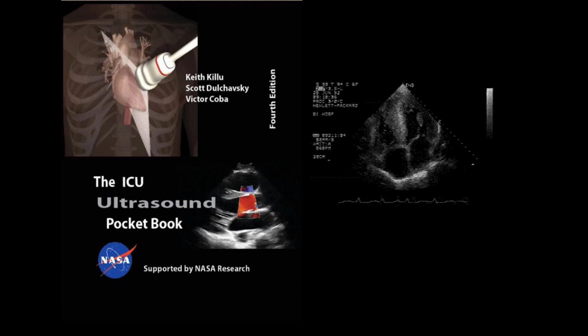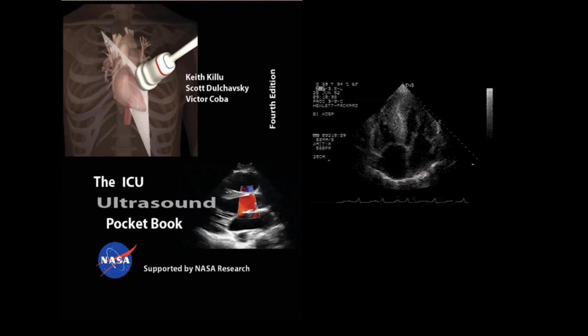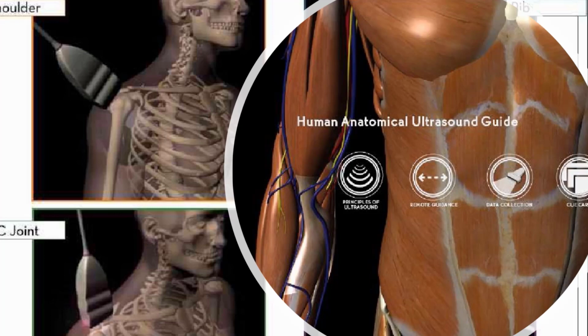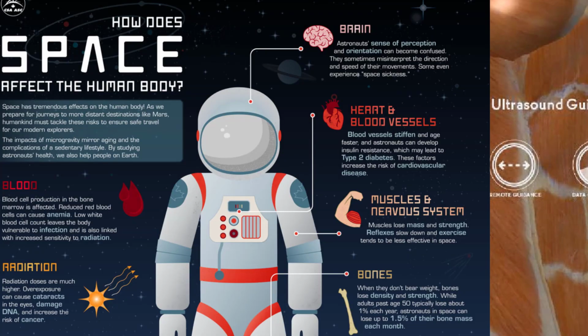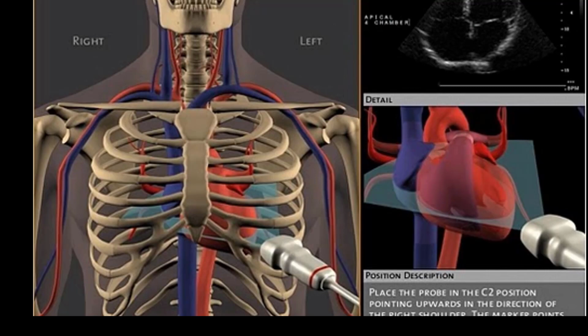To aid the astronauts in clinical situations, such as when there's an emergency, NASA has developed a complete ultrasound pocketbook, which shows step-by-step how to perform exams and to interpret the images. With on-the-ground guidance, the pocketbook and e-learning materials available aboard the International Space Station, the astronauts are competent in utilizing ultrasound for diagnostic purposes. In fact, adapting ultrasound to space has actually evolved the number of exams that can be done utilizing ultrasound. This slide allows us to take a peek into the ultrasound handbook for astronauts.